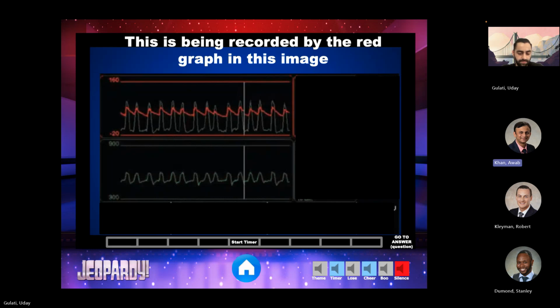I would imagine it's the pump, the Impella itself, the pressure it's generating or the stroke volume. I think it's the measure of your aortic pressure. It's your measure of your aortic pressure. Aortic pressure, Uday? Yep, absolutely, man.